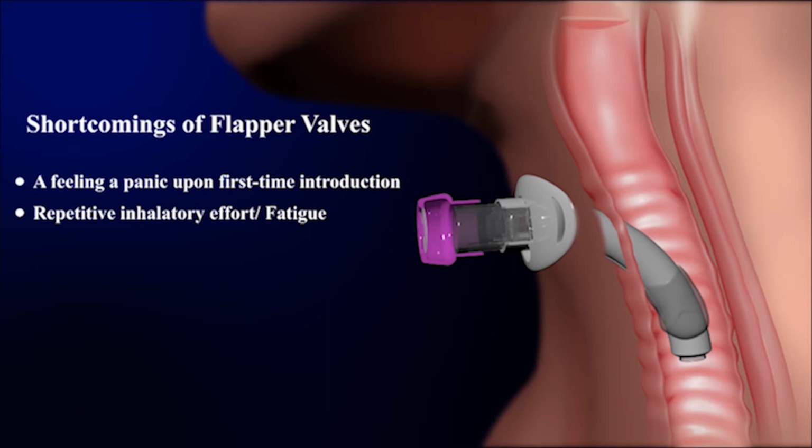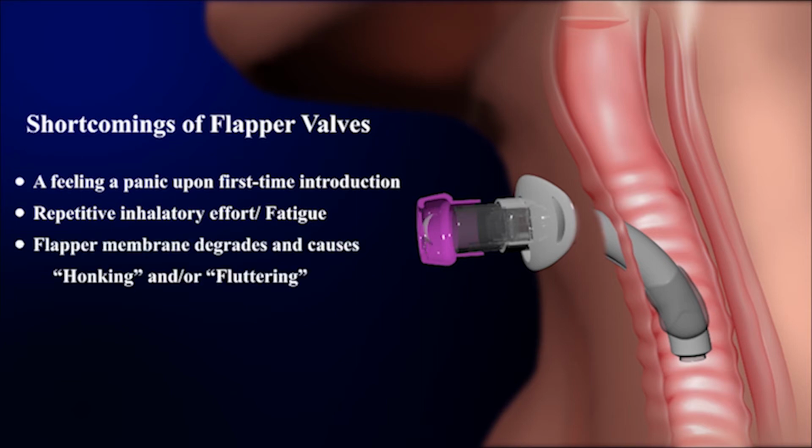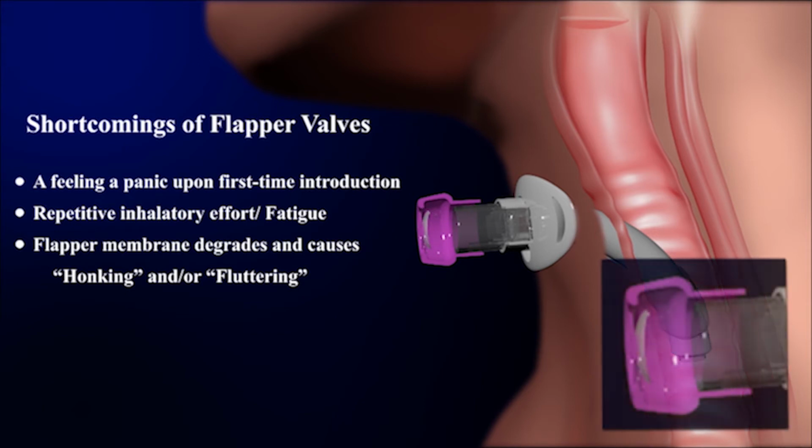valves. One final significant clinical problem noted with these valves is that the flapper membrane tends to degrade over time with repetitive opening and closing, resulting in the uncomfortable honking or fluttering type of noise that is observed with a flapper valve that has been used for several weeks.